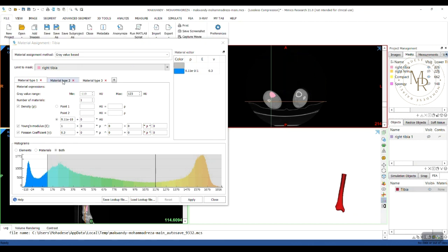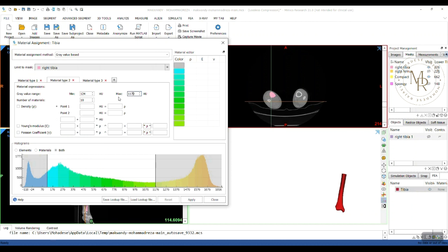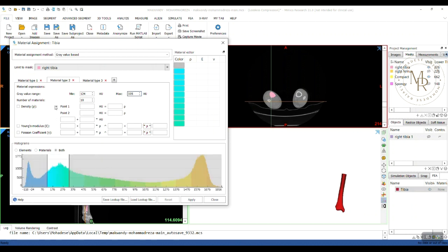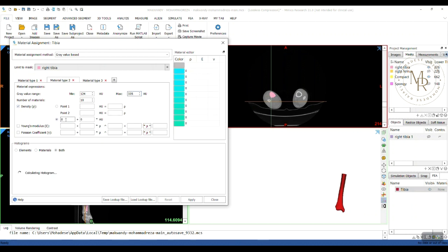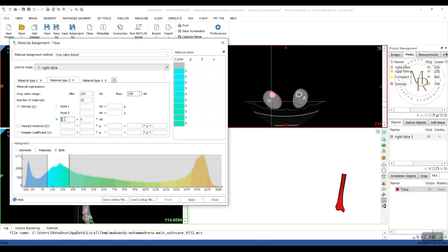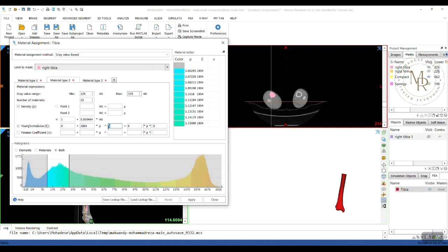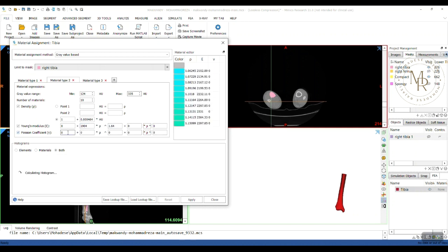Alright, now let's go to the second material, spongy or cancellous bone. Here, I change the maximum bound to this value. And now, I'm going to use the equation for the density. Pay attention to the units. And here, for Young's modulus, and the Poisson ratio.